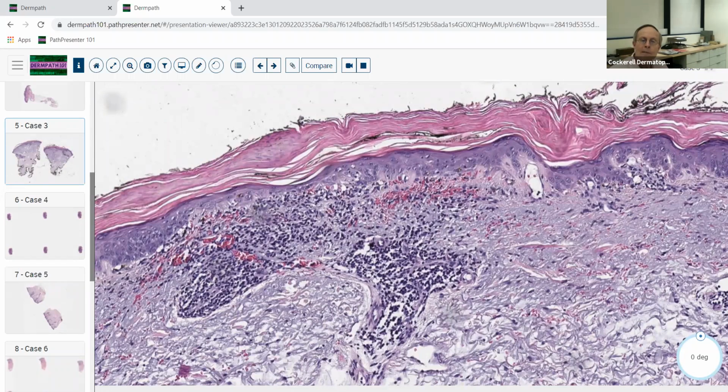And notice here we've got the band-like infiltrate of cells. We've again got the vacuolar alteration. We've got the extravasated erythrocytes. We've got this adherent parakeratosis over a broad front. Again, if you take somebody that's got Pityriasis lichenoides and you scrape off that, really it's more of a scale crust, if you will. It will bleed a lot of times, just like when you peel off the scale and somebody's got psoriasis, the so-called Auspitz sign. The same thing can happen in this situation also.